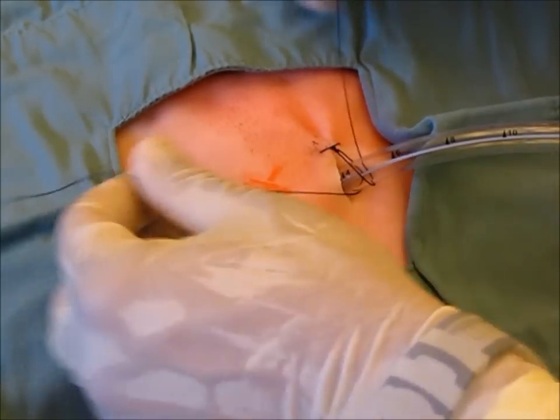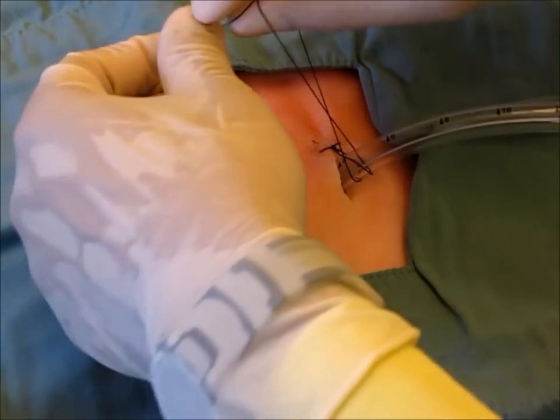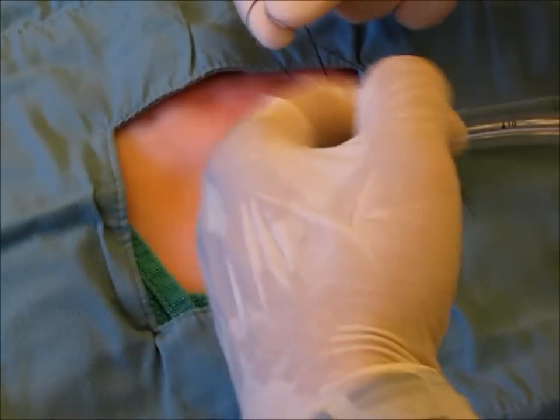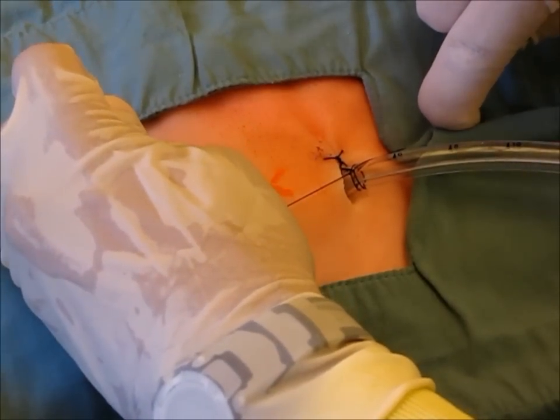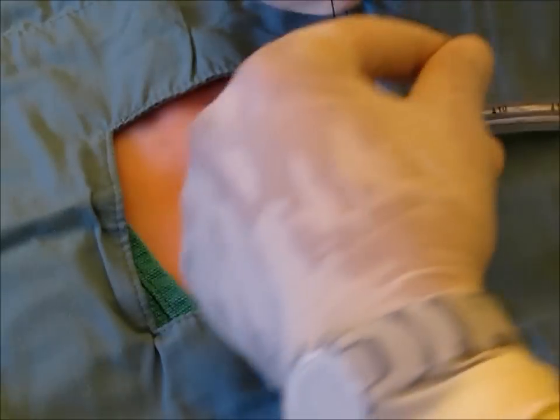When securing the chest tube, it is essential to secure it tightly enough to cause an actual dimple in the chest tube, however not overly so as to occlude the chest tube.